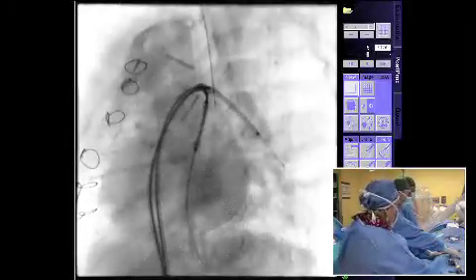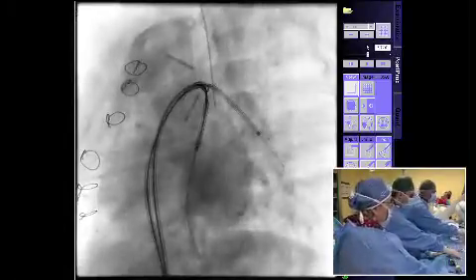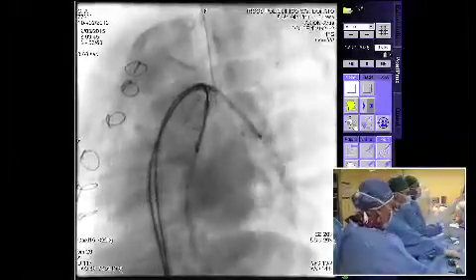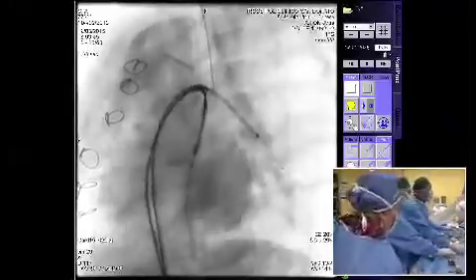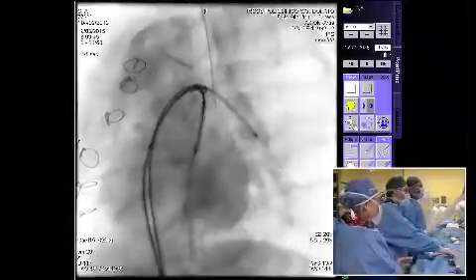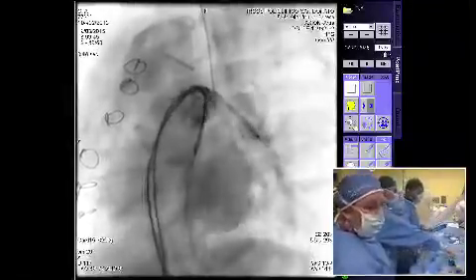Ok, ce l'abbiamo. Siamo pronti? Ok. It's quite a pale injection because of the stent, the balloon, etc. So we can pull back a bit this stent. But first of all, I should go by treating the right PA. We are quite in a good position for the right PA.